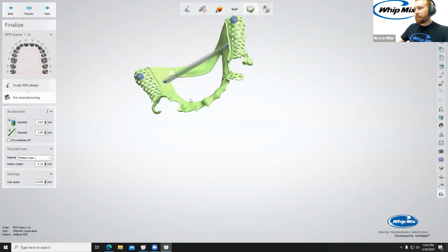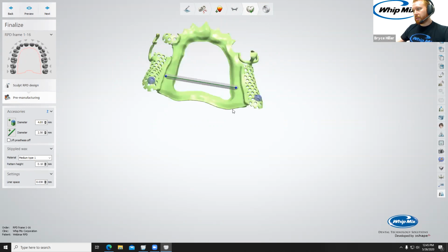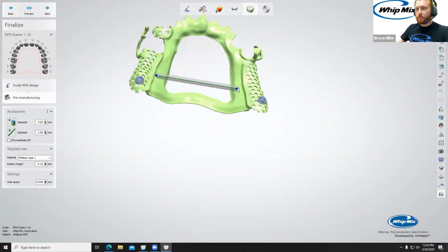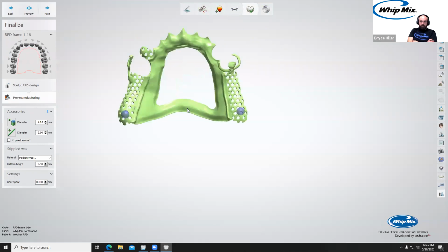I mean, really, even SLM, I don't know for sure, but I would imagine for SLM they probably use a support bar to prevent warping. I don't know for sure though. I could be wrong. I think they would, just because with SLM you're essentially heating up a product. Yeah. And as soon as anything heats up and cools, you're going to see a little bit of warpage. So that stability bar, I think, just about for anything for additive manufacturing is going to be beneficial. Yeah, I would think so too.